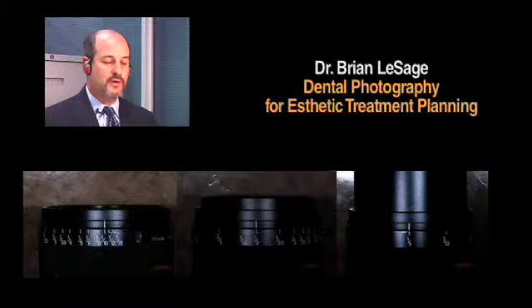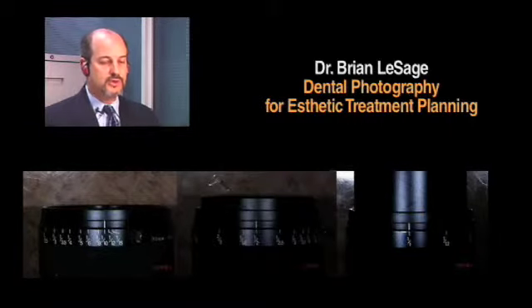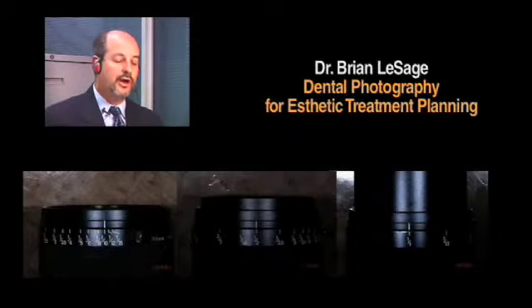When we take a 1:10 view, it's a full face image, and there are certain parameters that I'll go through very specifically. Look through your camera. When you see that average, because some people have bigger heads and some people have shorter heads, but on average, when you see where that 1:10 is on your lens, just put a small mark on the lens.